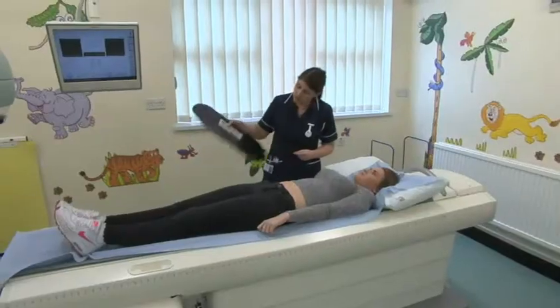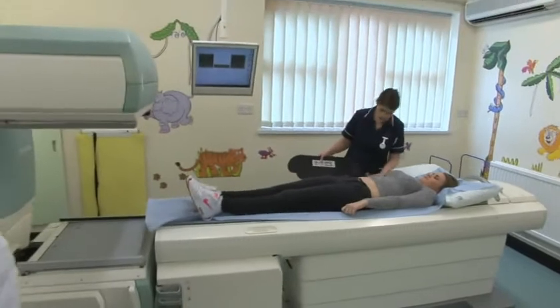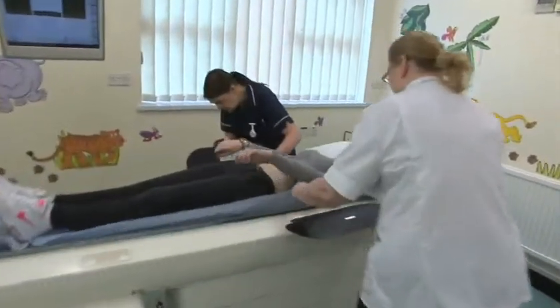We're going to raise the bed up, we're going to pop some armrests in, just to make you comfortable. So if you just lift your arms up a wee bit.